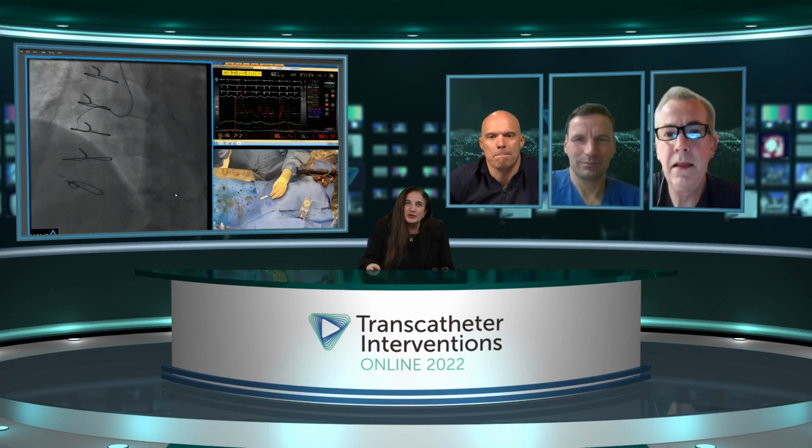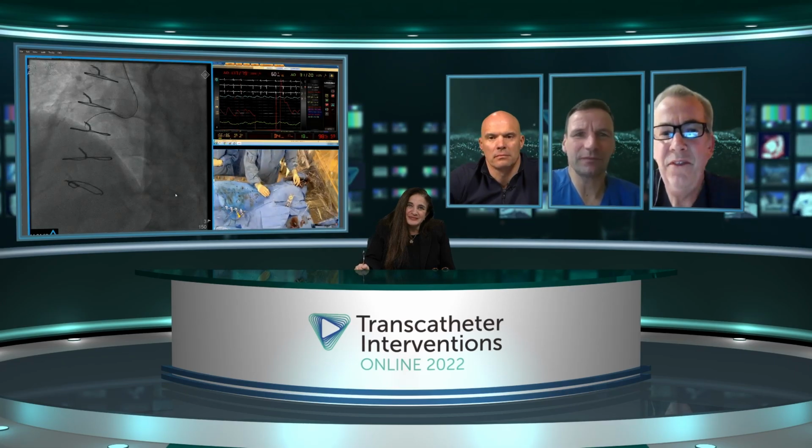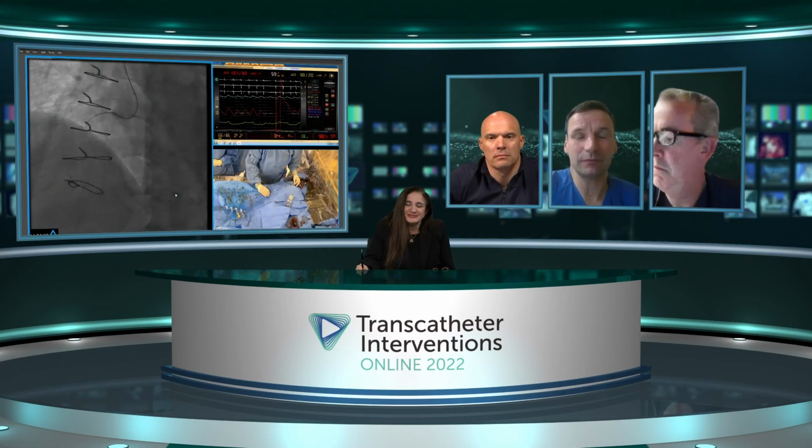It looks like a short occlusion. I think Margaret's going to get this. Yeah, so when I saw this, I thought this is a very challenging case, also because if you want to go retrogradely, you have to use epicardial collaterals. But now with better imaging, for me, it seems to be possible if they do it antegradely. And I'm looking forward to seeing if Margaret is really using the new techniques she has shown in her presentation. So hopefully this will be a good option to see how it works in clinical practice.